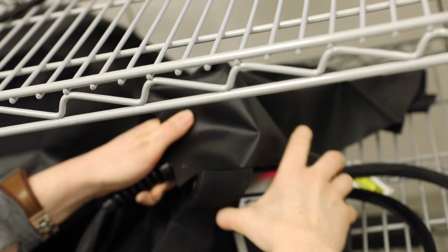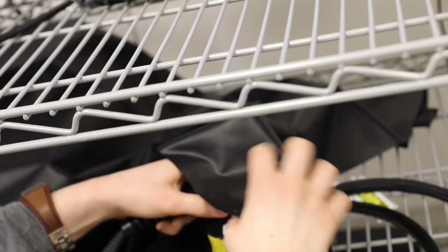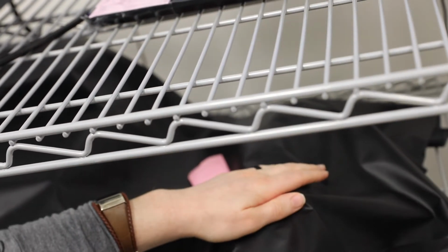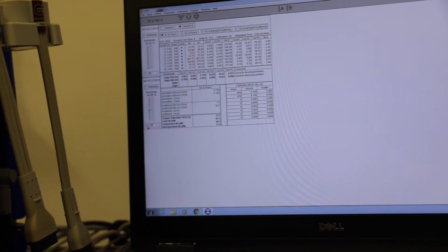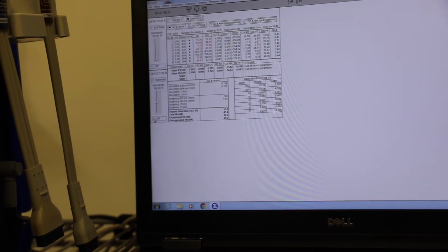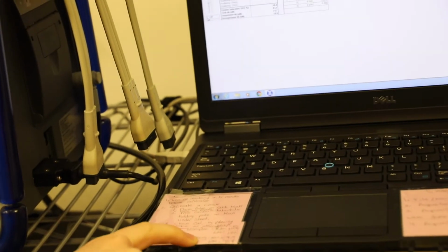So this block has its own values for absorption and scattering so that we can check to make sure that it will pick up the correct values. So all we have to do is put the probe on the checking block and turn it on. We don't have to hit calibrate or anything. You just turn it on. And now you're just going to check that these numbers match these numbers on this sticky note on the computer.